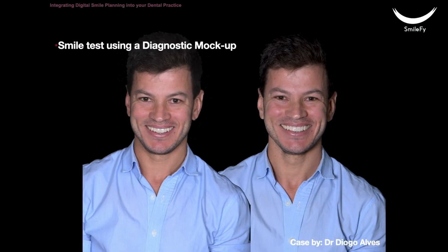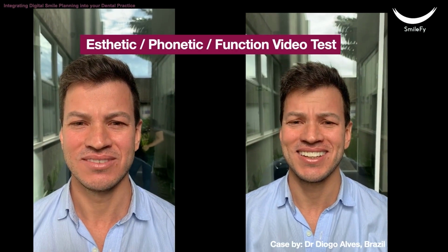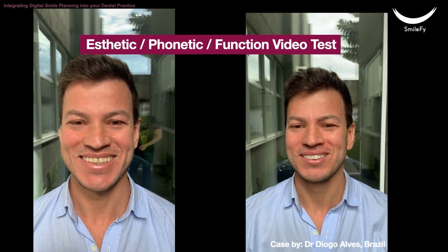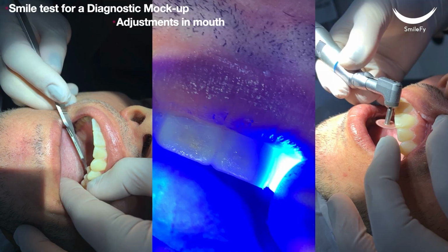So with the model already printed, which you can 3D print in-house, or you can send it to your lab for them to 3D print it, you will be able to then create a silicone key and perform a wax-up trial for the patient to try on the smile, and also for you to evaluate the aesthetics and function of the wax-up that you created. If there are any adjustments that you need to make, you can simply do it in the mouth. That way you can save time, you can save cost, so you can proceed with the teeth prep and temporization.